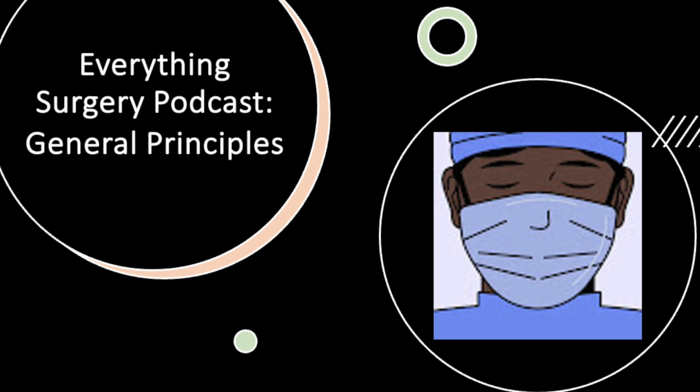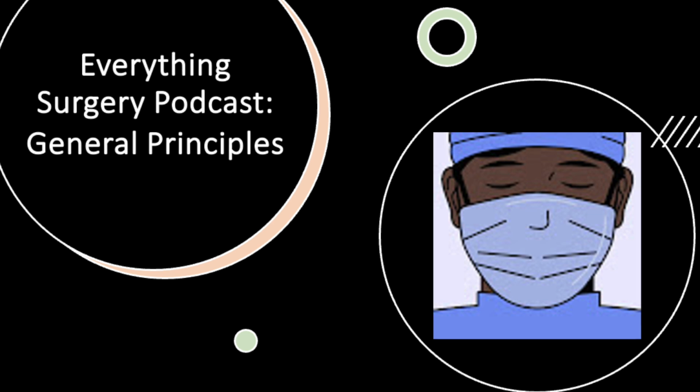The systematic 8-step approach in clinical practice. A standard 8-step method is used to ensure that no critical findings are overlooked. Let's walk through each of these steps together. Step 1. Rate. Begin by assessing the heart rate. A normal rate ranges between 60 and 100 beats per minute.